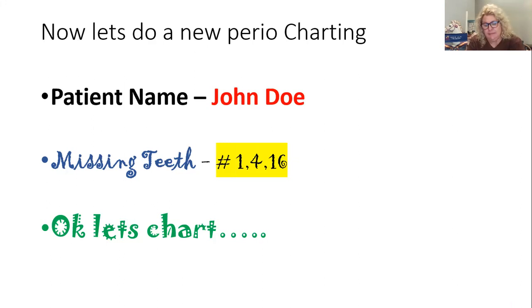We're at the distal buccal of tooth number 32. Now we have no missing teeth down here, so you're going to have to keep up, okay? Distal buccal of 32. 4, 4, 4, 4, 3, 3, 3, 2, 3. Where am I? You should have said distal buccal of 29.